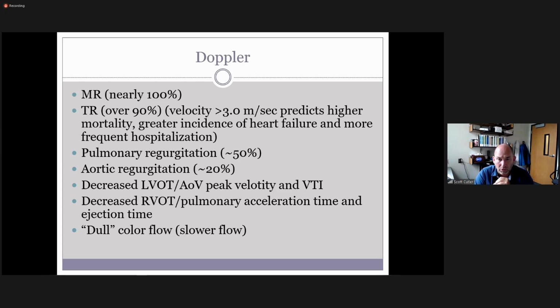And sometimes they just don't know enough about what they're actually ordering. And you might need to educate them to say, I need the order to say this. If you're doing a study that doesn't have Doppler built into it and they order just a 2D exam, but you need Doppler information, it's important that you have the order state that it's for Doppler as well. Otherwise, you're not going to get paid for it. And you really can't diagnose it these days without having Doppler.